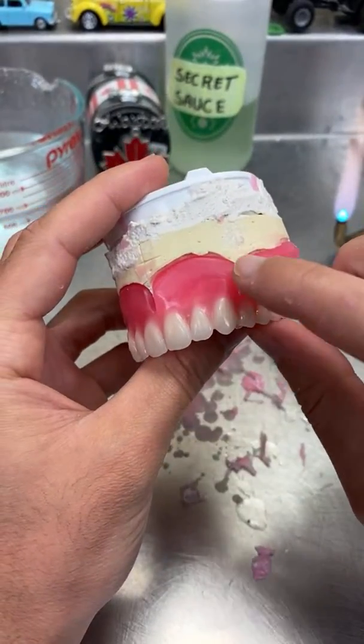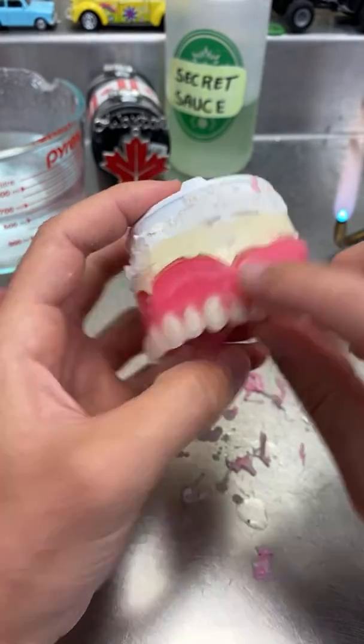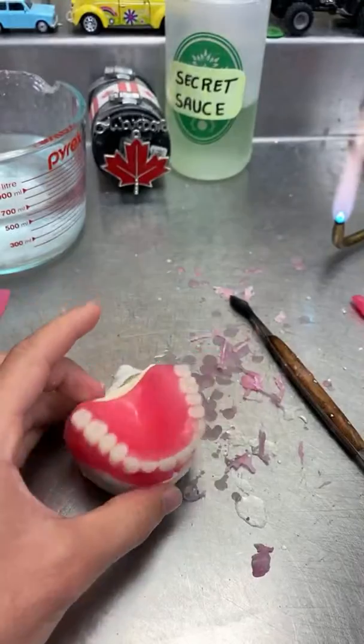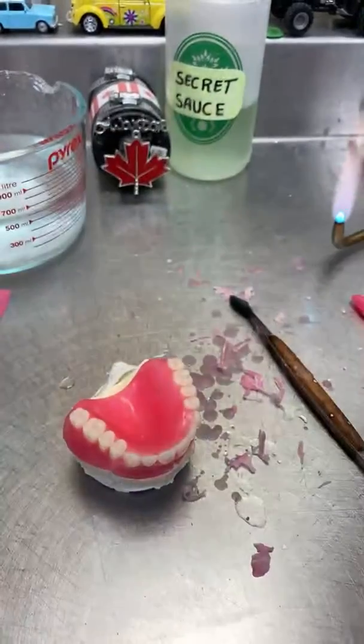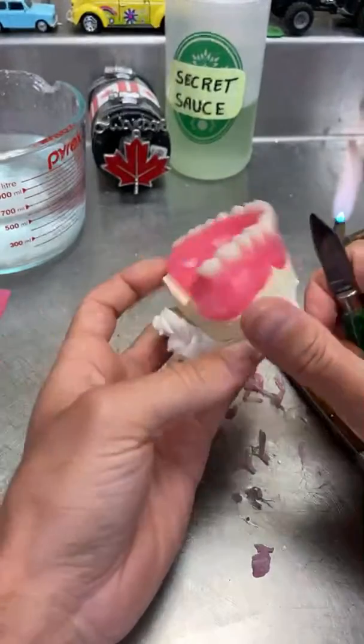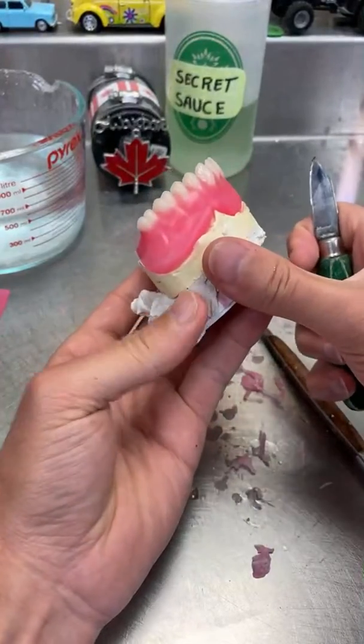I notice there's a little bit extra here, so I'm gonna take that down. Actually, when it's on the model, it's okay to do that because my thumb will be on here.